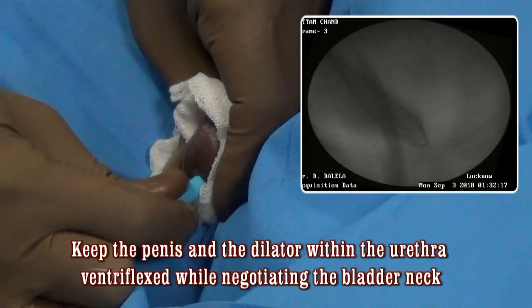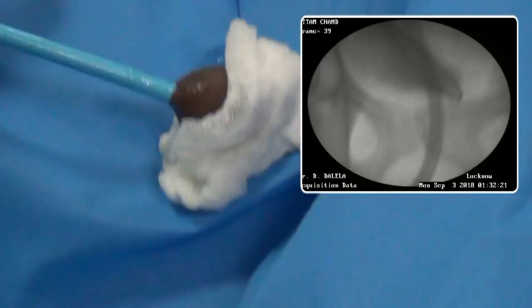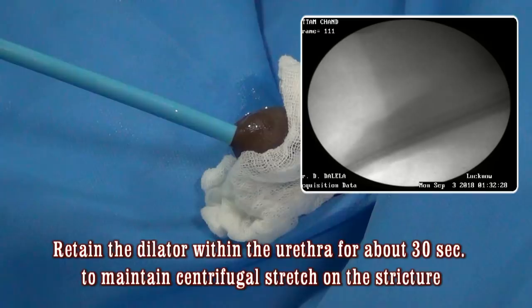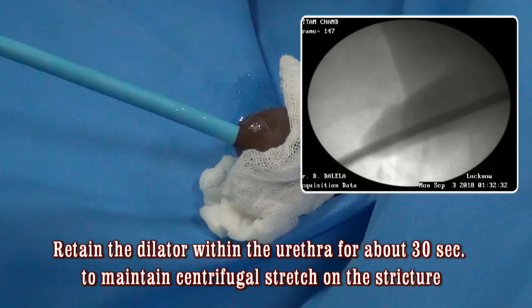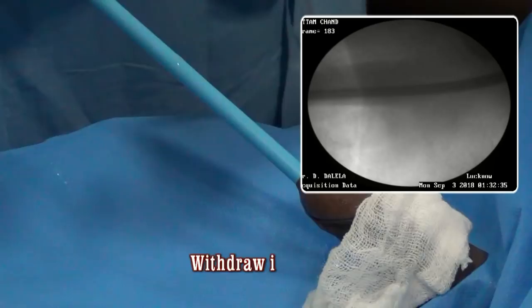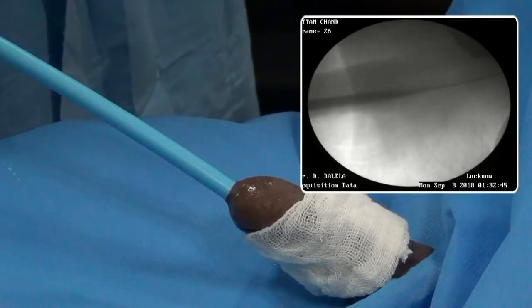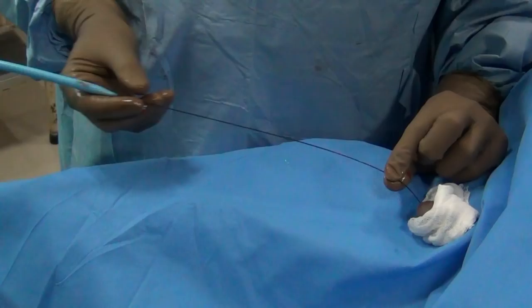Having dilated the stricture, you should retain the dilator within the urethra for about half a minute to maintain a centrifugal stretch on the stricture. Having done that, withdraw the dilator out of the penis and then watch for any blood coming out of the external urinary meatus. The absence of blood at the meatus is a sign of your gentleness — that is what you must always aim for.